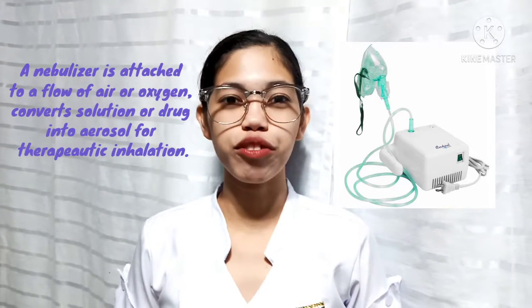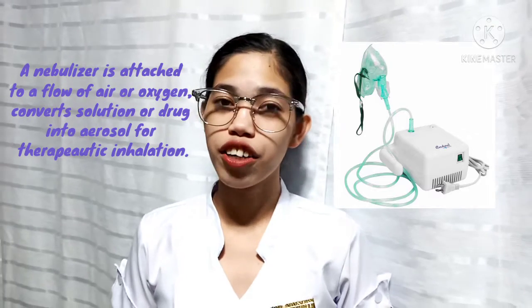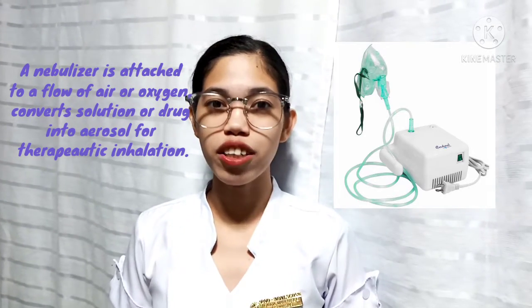So for today's video, I'm going to perform an administration of medication by inhalation or nebulization therapy. A nebulizer, attached to a flow of oxygen or air, converts a solution of drug into aerosol for therapeutic inhalation.